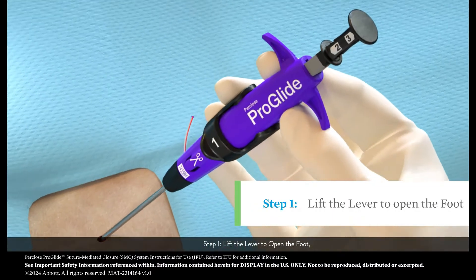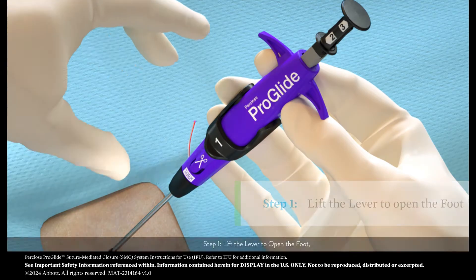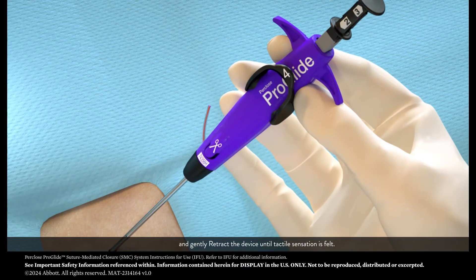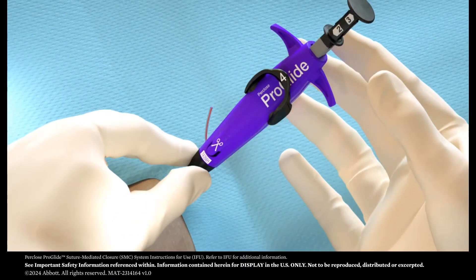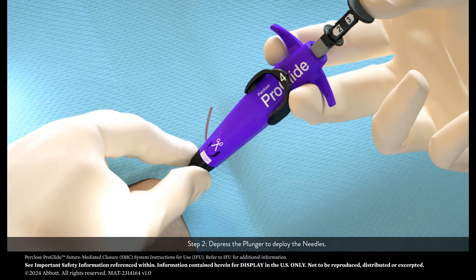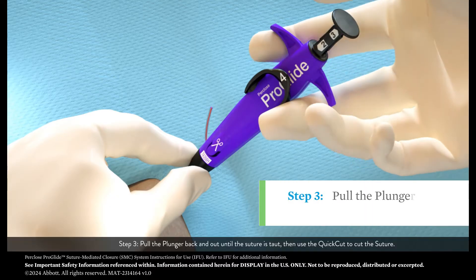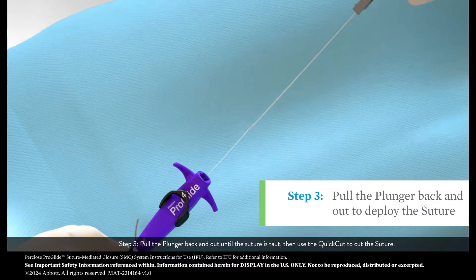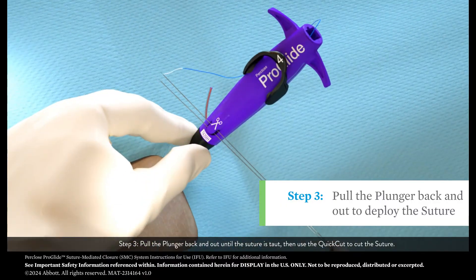Step 1: Lift the lever to open the foot and gently retract the device until tactile sensation is felt. Step 2: Depress the plunger to deploy the needles. Step 3: Pull the plunger back and out until the suture is taut, then use the quick cut to cut the suture.